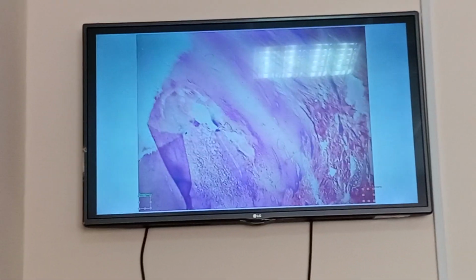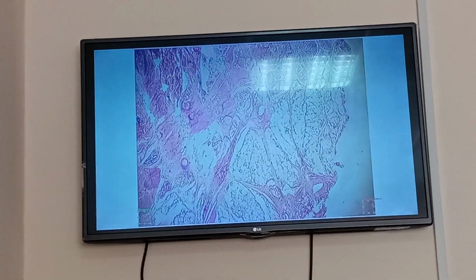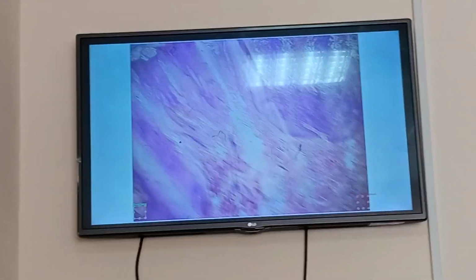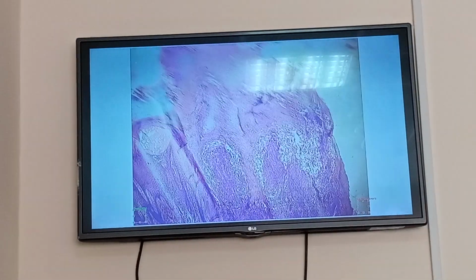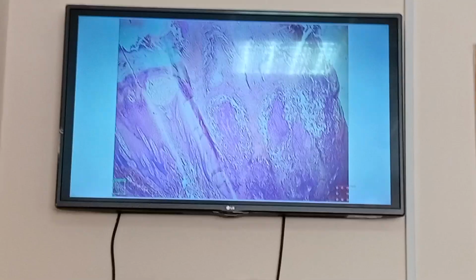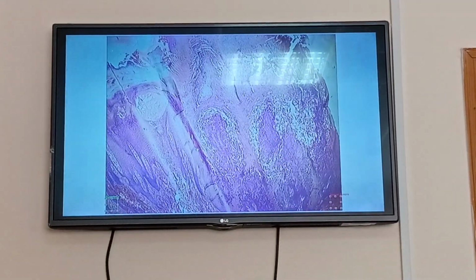This is skin. This is hypodermis. This is dermis, with the sweat glands. Thick skin, there are no hair follicles and sebaceous glands. Thick skin, and what you can see here. Epidermis is thickened, very thick. Hyperkeratosis is visible, which means hyperproduction of keratin.